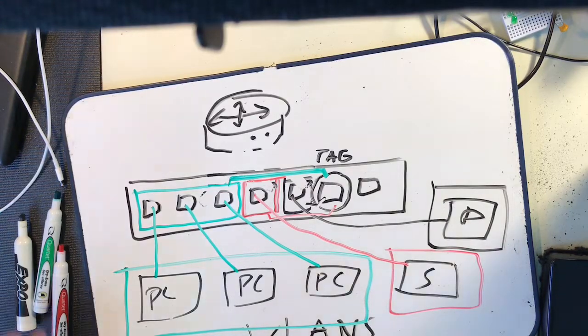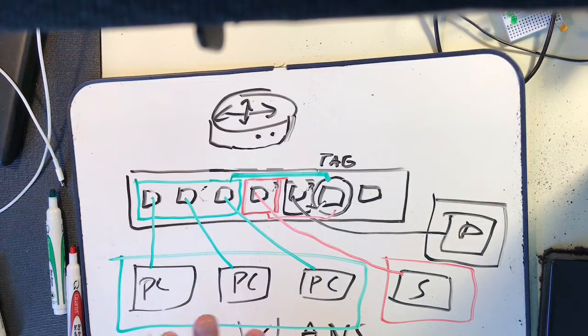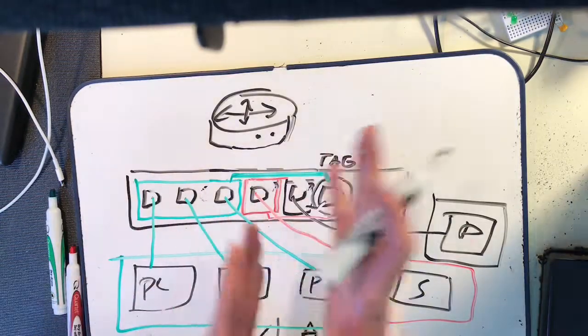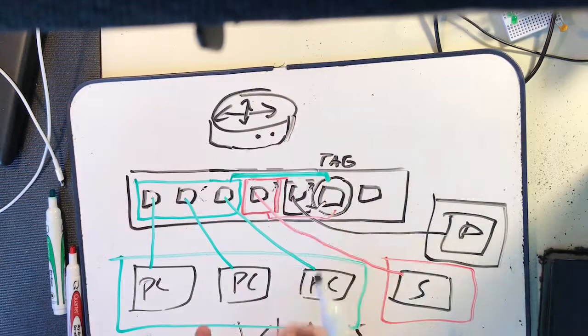Now that might seem a little complicated and a little tricky, but the reason for this is these virtual switches still need to have the router to know where this stuff goes. And rather than having 3 separate connections, what if we just multiplexed our data in a way that we can just send it all through a single cable? And it does that through the tagging process.